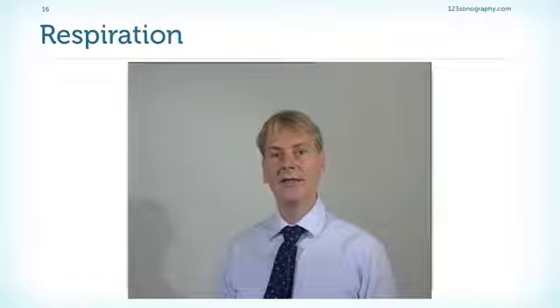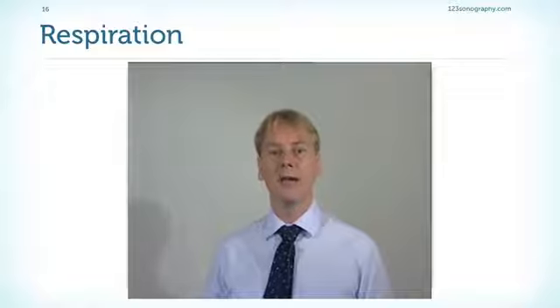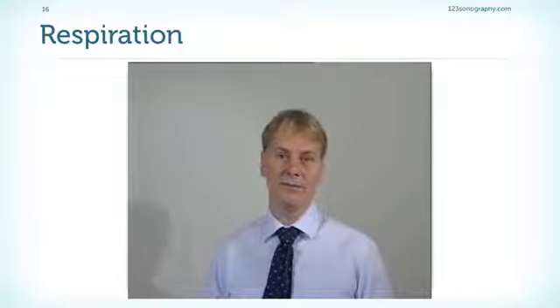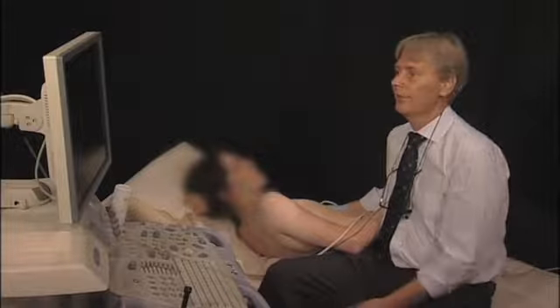So it's obviously a difference if the patient inhales or exhales. Let's take a look at what happens if the patient breathes. The lung has a very big impact on the quality of the images, simply because we cannot image through air, and if the patient inhales or exhales, we will change the windows and thereby change the quality of the echocardiogram.